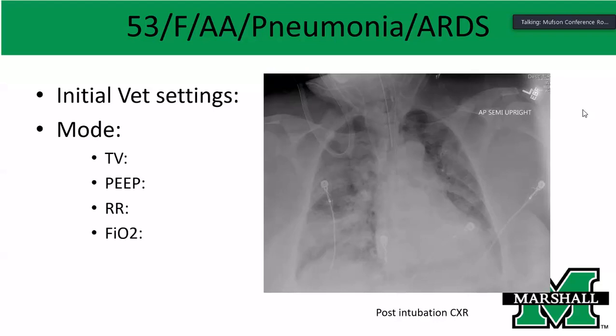And 450 is too much for anyone who has that bad X-ray. Unless of course they're 180 centimeters or higher, then 6 milliliters per kilogram of their ideal body weight can actually be 420, 430. So if I'm shooting in the dark, I would do 350 for a female, 400 for a male, and go from there, before we get a height and actually do the measurements.